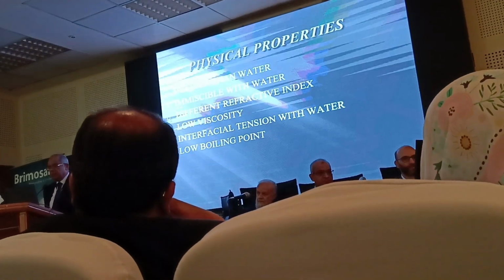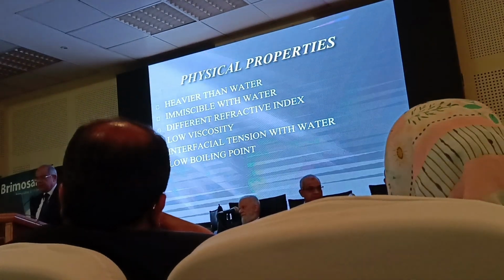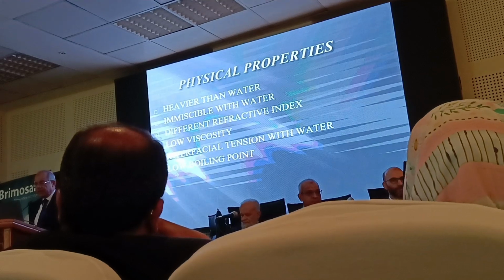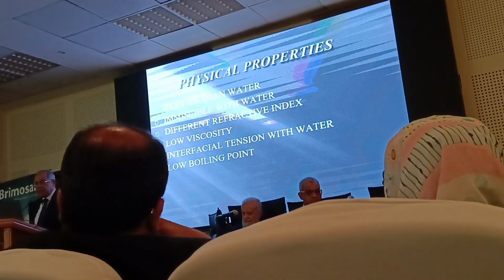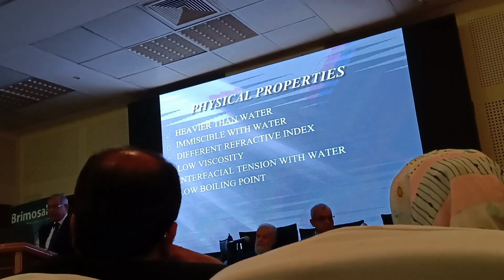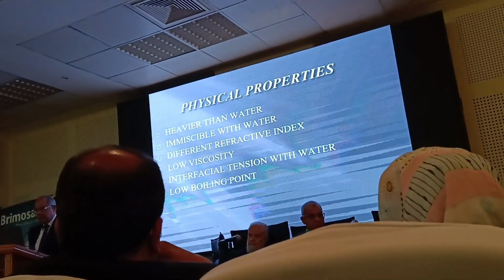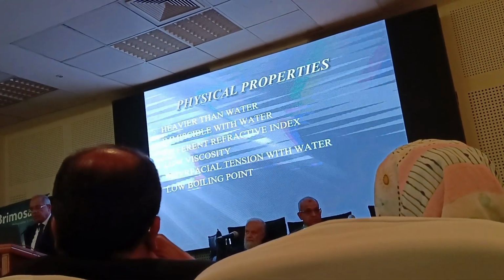They are immiscible with water, and they have a slightly different refractive index that allows us to identify the interface, with a low viscosity, allowing easier manipulation than silicone, for example. They have an interfacial tension with water that's high enough to make globules, definite globules.